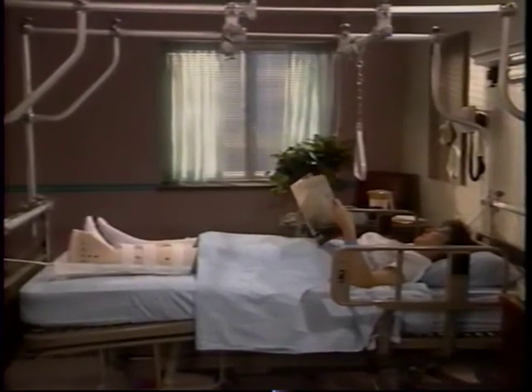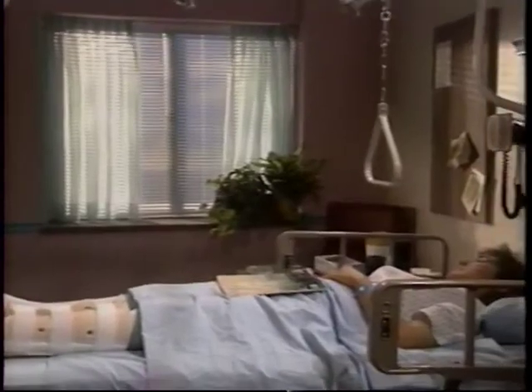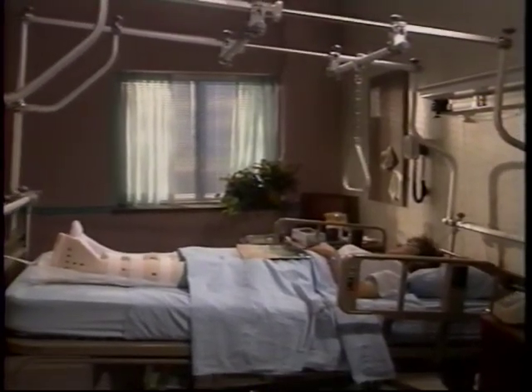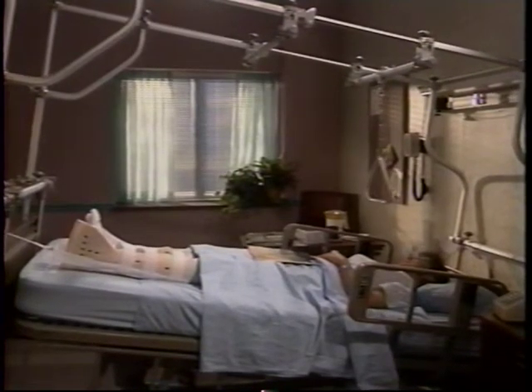Sometimes inadequate countertraction may cause the patient to continually slide down toward the traction pull. In these cases, it may be necessary to provide increased countertraction by tilting the bed away from the traction force. This is done by placing the bed in Trendelenburg position.